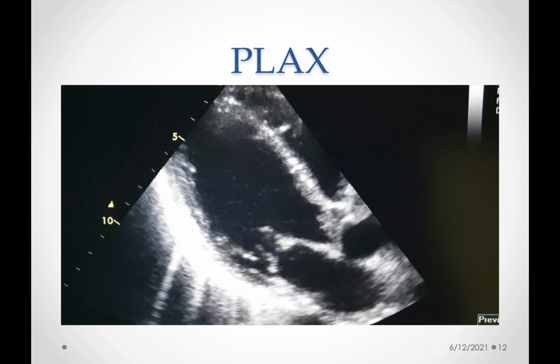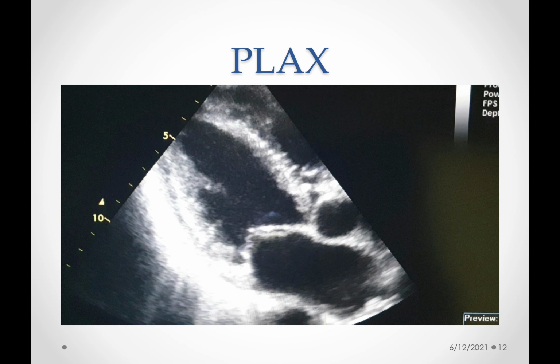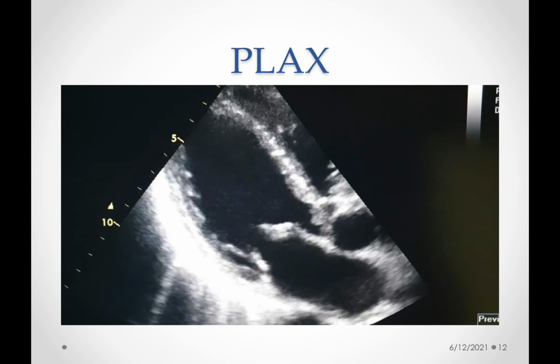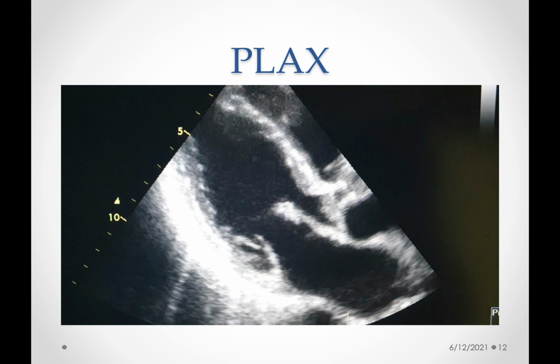And that's one more video. Your left atrium and your left ventricle and your aorta on the right side, and the right ventricle on the top side of the screen. Notice here that the gain needs adjustment, and that's why you can see very bright white color.